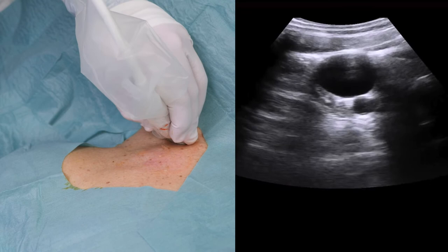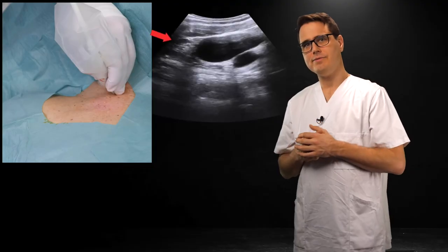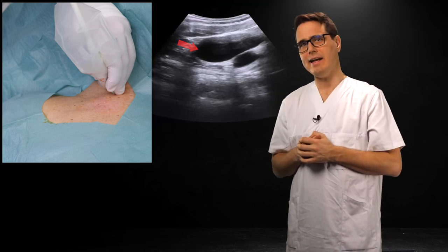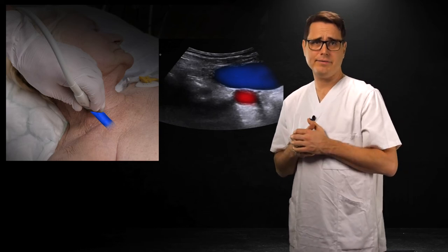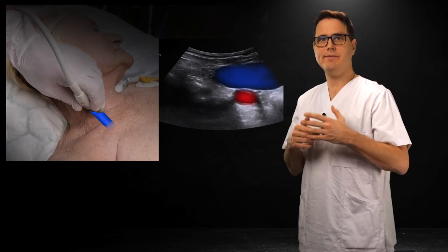So far we've focused on the subclavian, but like we've said before, you need to be very comfortable with the IJ first. Fortunately, all the in-plane axis techniques are applicable, but with a slight adjustment. The full long axis view can be difficult to achieve on the neck with most linear probes — the solution is the oblique view. In the oblique view, the vessels are sliced at a 45-degree angle, which elongates the vein. Note the distance from the vein to the left part of the screen where the needle will enter — this allows for seeing the needle before it reaches the vein. This allows for a short axis-like, side-by-side identification of vein and artery, but with a long axis-like cannulation path, while keeping the artery safely visualized at all times.